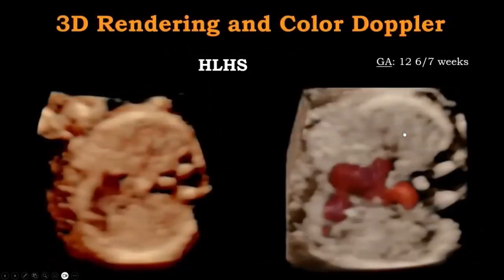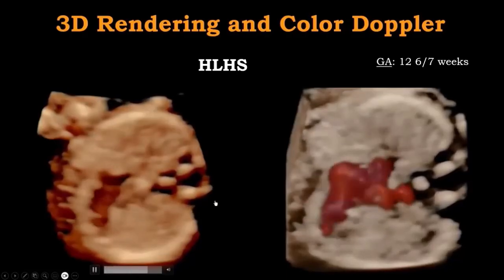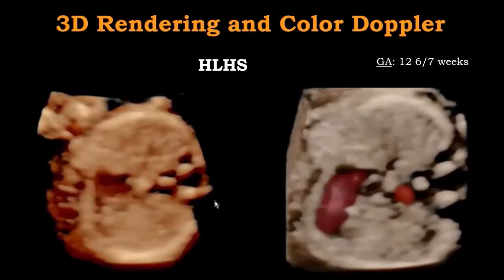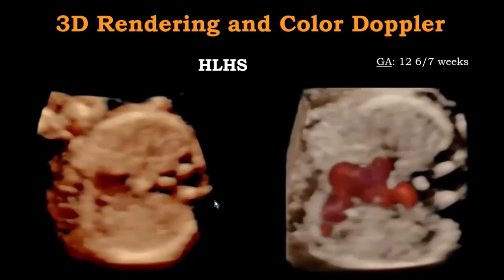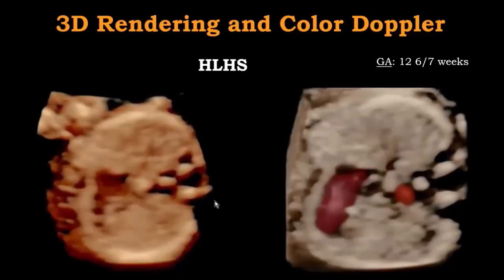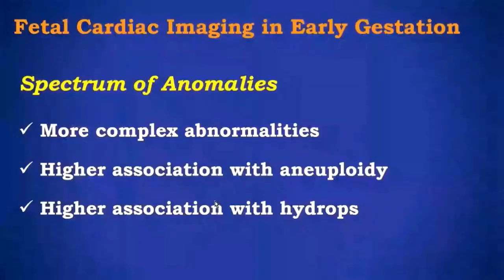And finally, another univentricular heart. This is the hypoplastic left heart syndrome. We can clearly see just the tricuspid valve going. And what's really remarkable about those images is that it helps not just to visualize the anomaly, but to significantly ease the communication with the other professionals, like the pediatric cardiologists, who are still very hesitant to consult the patients that early, and the other providers such as the surgeons, so that when they see pictures like that, they feel more confident to perform the counseling.